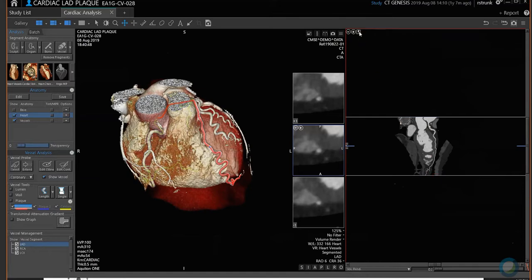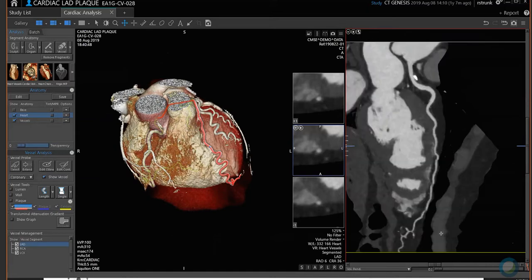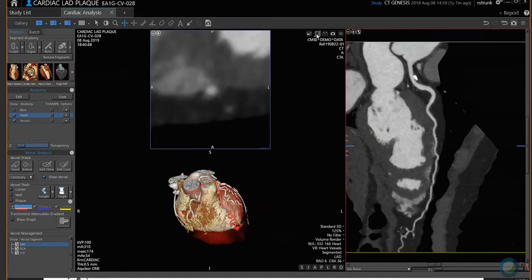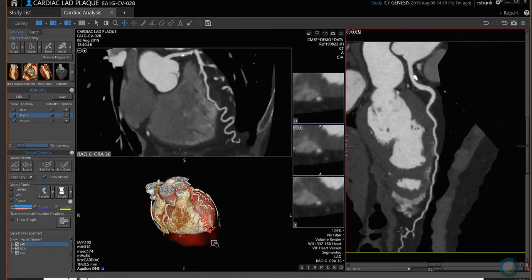There is a little lightning bolt and a plus — what that does is make it a little bit bigger. There is a different layout that I find more useful. If you come up here, there are three little dots. If you click that twice, in addition to having this 3D image and your curved image, you get what we call the cath image. You can see the cath views here.